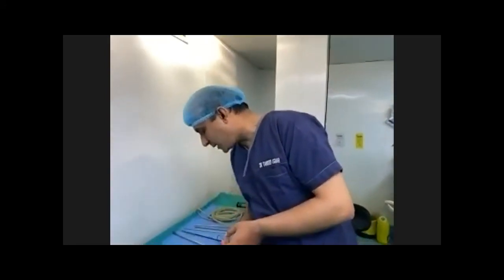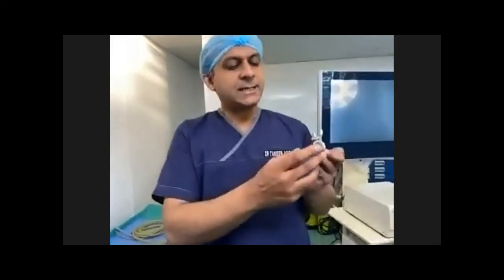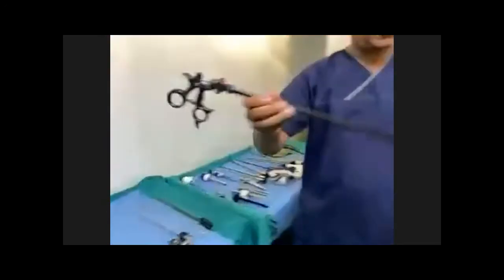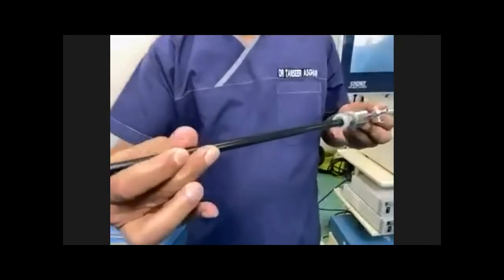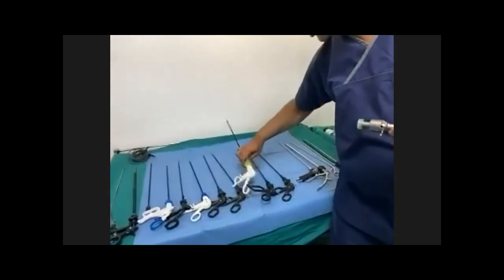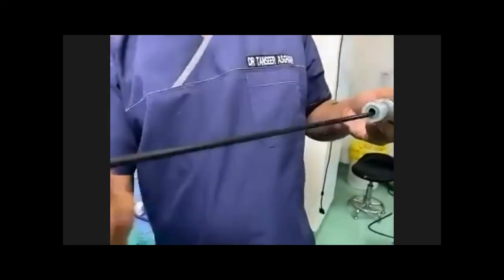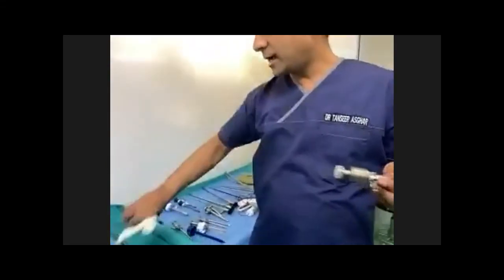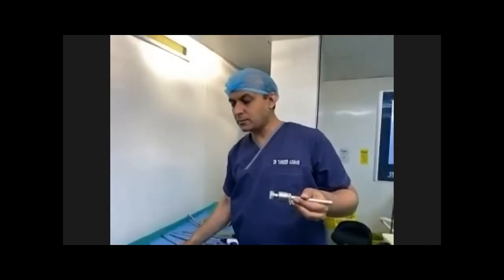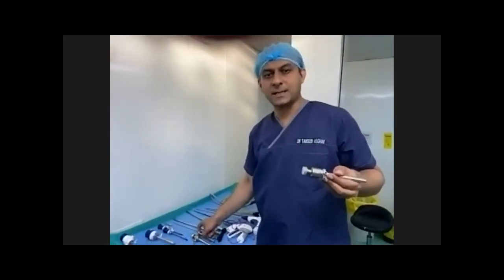So if you are using a reusable trocar, you can put a 10 mm instrument inside like this. You are putting a 10 millimeter instrument inside. But if you have to put any instrument of 5 millimeter, and if you go inside it, it would leak, right? So you have to have something which helps you to use the 5 millimeter instrument, because as we all know, the usual instruments in laparoscopy are 5 millimeter instruments, especially in basic laparoscopy.